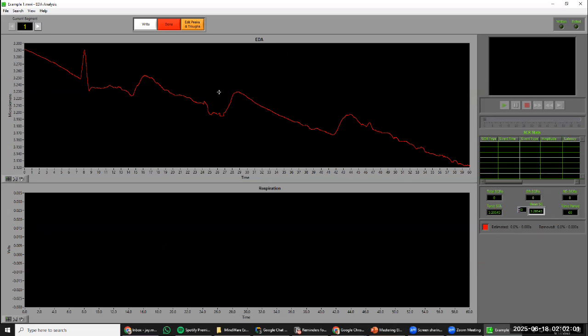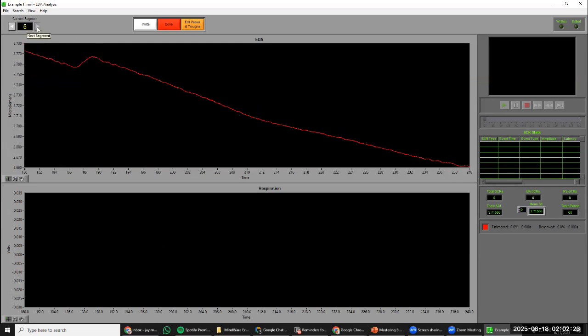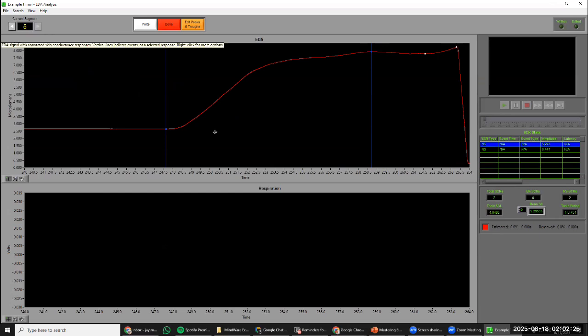So when you see something like this, it's not like there's inherently an issue with it. Just look at the range. If it's a very small change that's only a couple tenths or hundredths between the two, that's probably what's occurring. So I would recommend looking forward to see if this continues to occur for this person. Do we actually see a segment in which we see any phasic change?